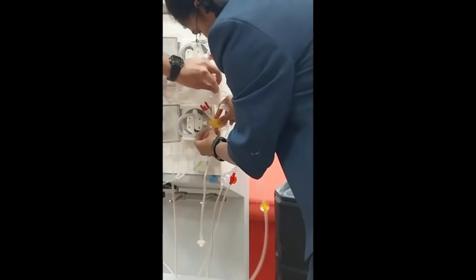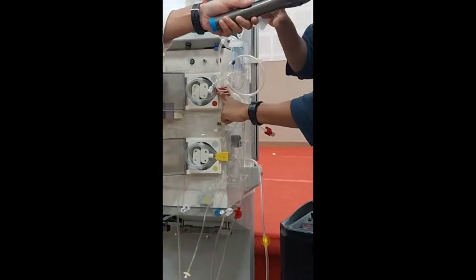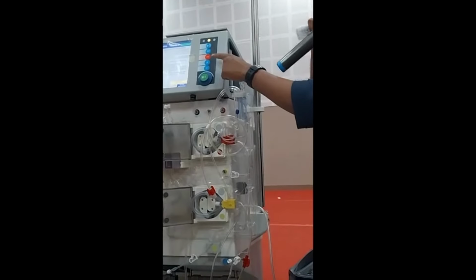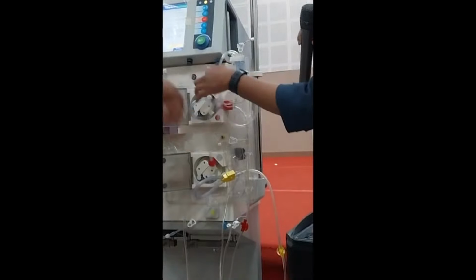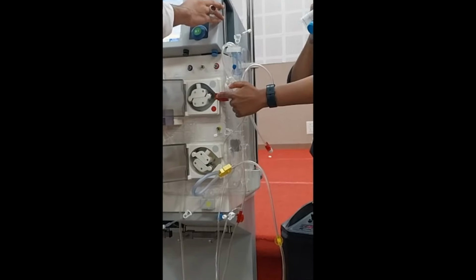To ensure that the tubing fits in perfectly into the pumps, hold the tubing in place and then press the start reset button, long press it. And when you long press it, the pump will roll and automatically the tubings will get fitted in.